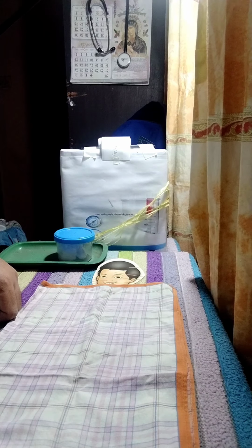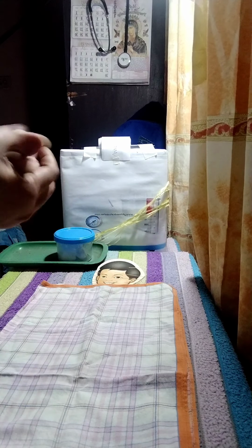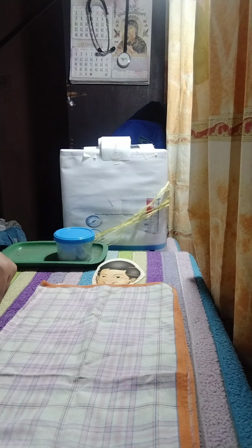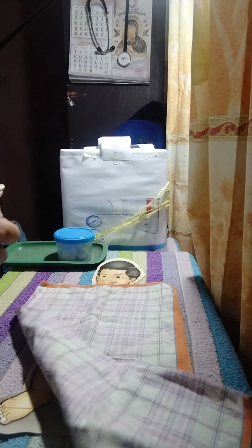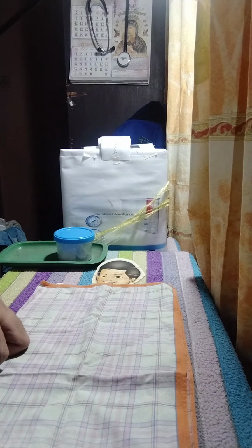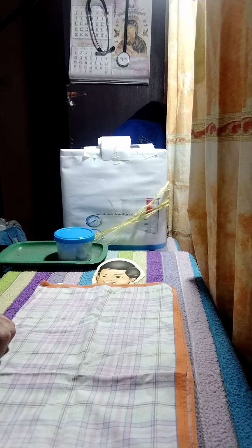Next, perform hand hygiene and put on PPE if indicated. Next, identify the patient. Good afternoon, sir. What is your name? Okay, sir. And then, close the curtain around the bed and close the door to the room.